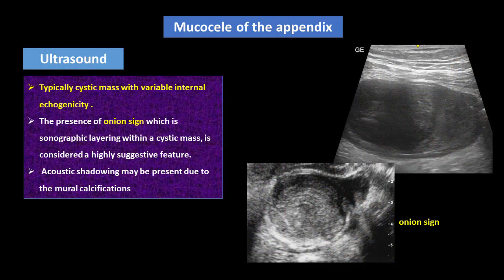On ultrasound imaging, mucocele of the appendix is typically a cystic mass with variable internal echogenicity. The presence of the onion sign, which is sonographic layering within a cystic mass, is considered a highly suggestive feature. Acoustic shadowing may be present due to mural calcifications.